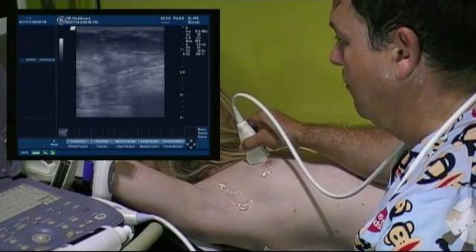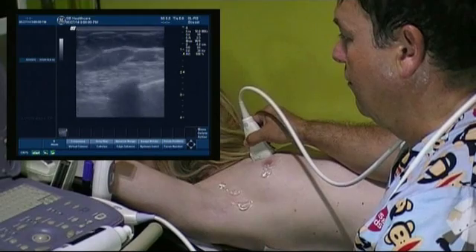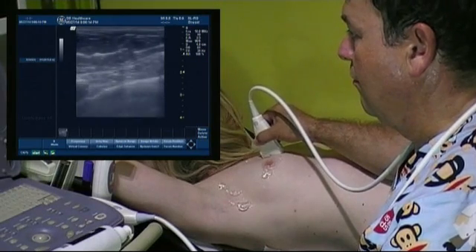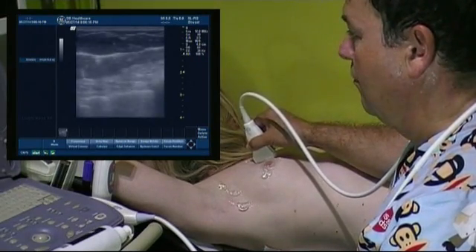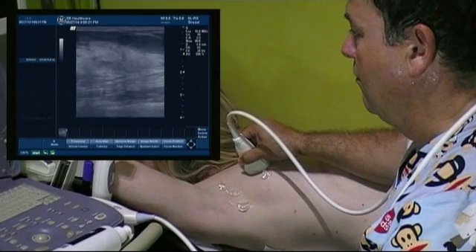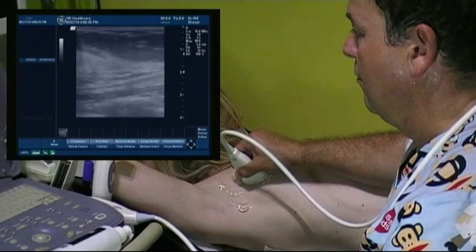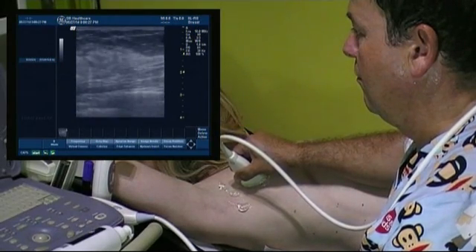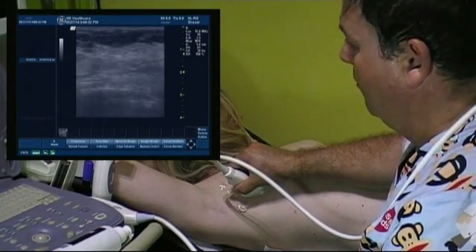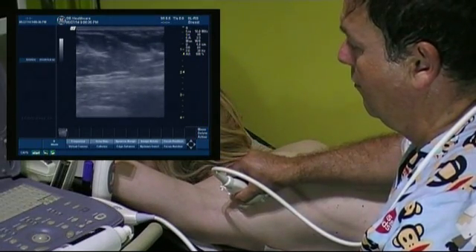Then, having the ribs as a guide, we move downwards until the rib we see at the bottom of the screen comes to the top. This way we overlap the scanning area and make sure that we cover the entire breast. We continue laterally again until we reach the edge of the muscle, then use the ribs again as a guide to move our plane one step down. With the same technique we continue until the whole breast is scanned, roughly three to four planes.